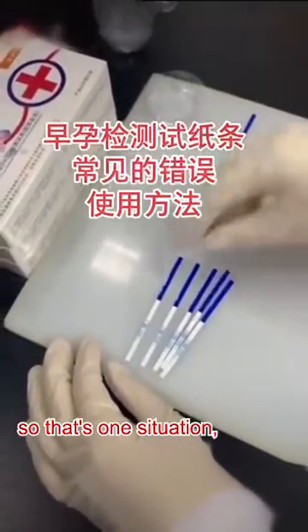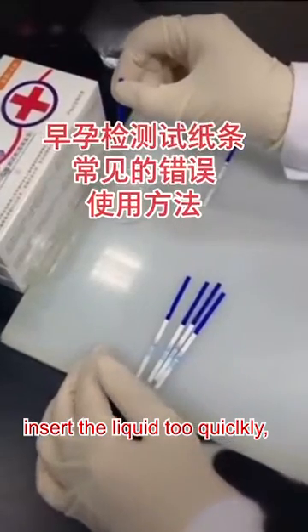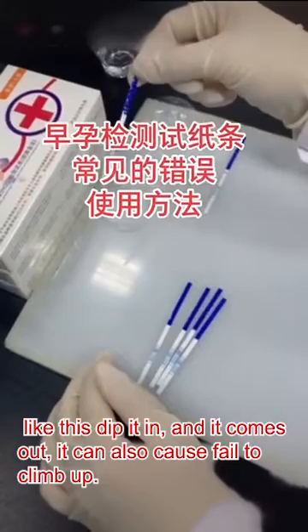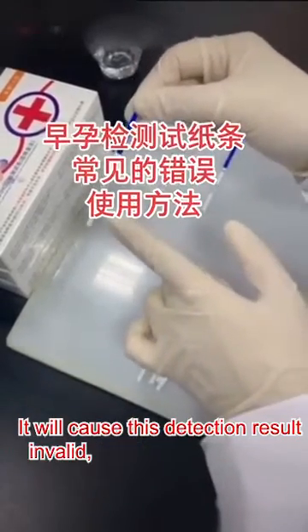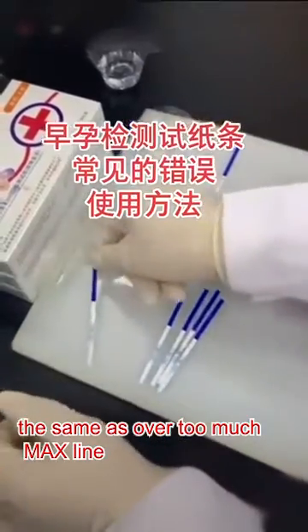So that's one situation. The other is that when there's enough urine, the strip is inserted into the liquid too quickly. Like this, dip it in, and it comes out. It can also cause the liquid to fail to climb up. It will make the detection result invalid, the same as going over the max line.